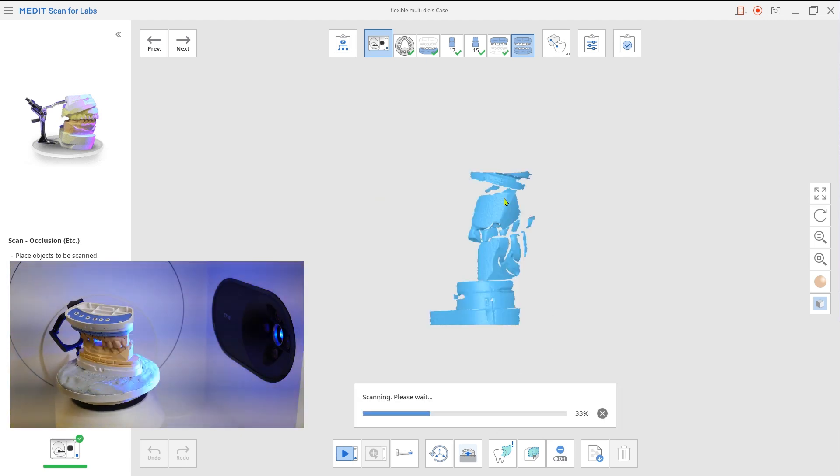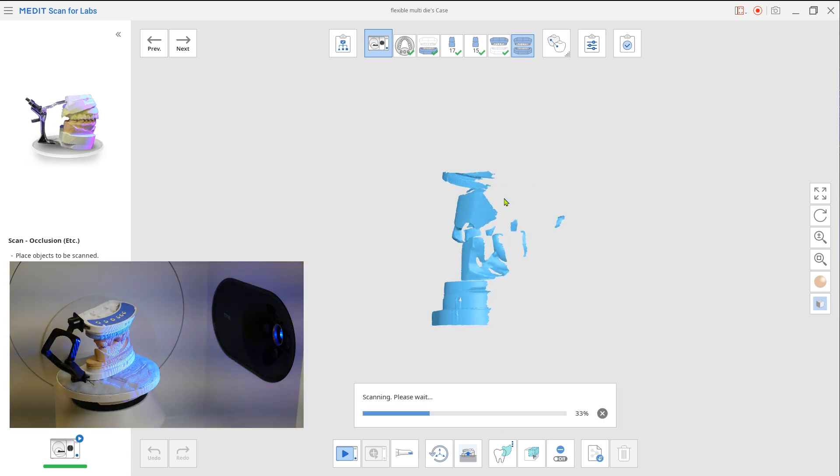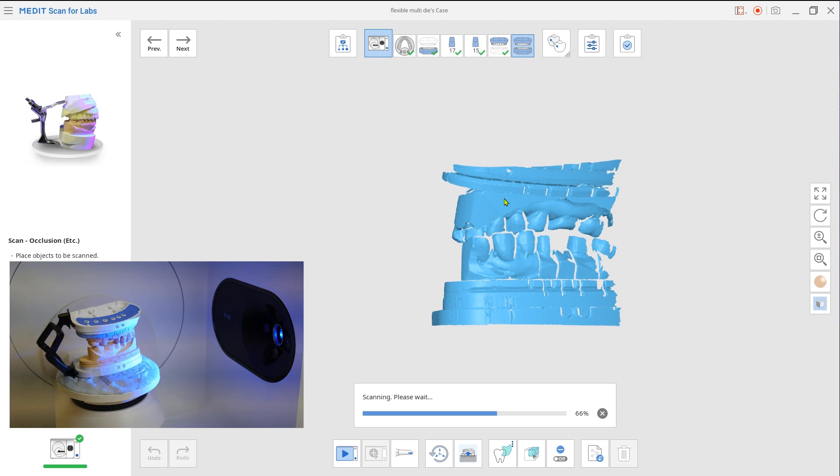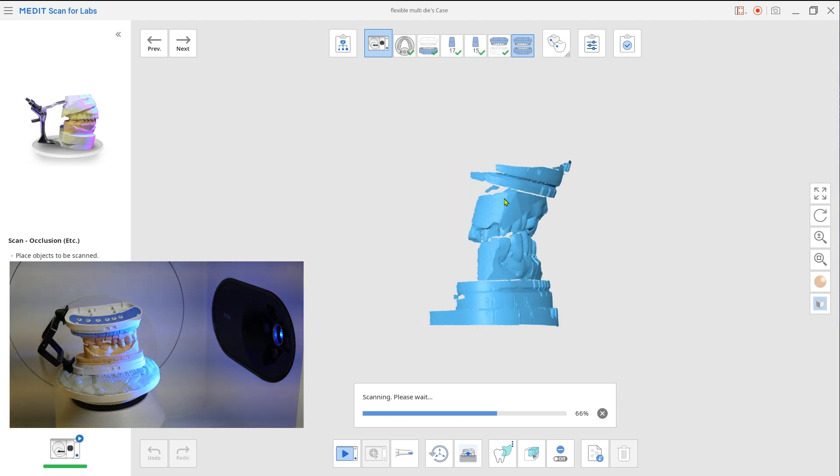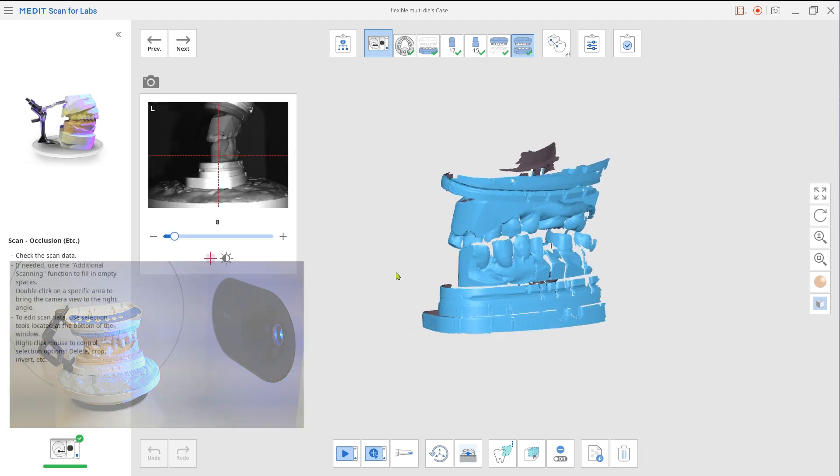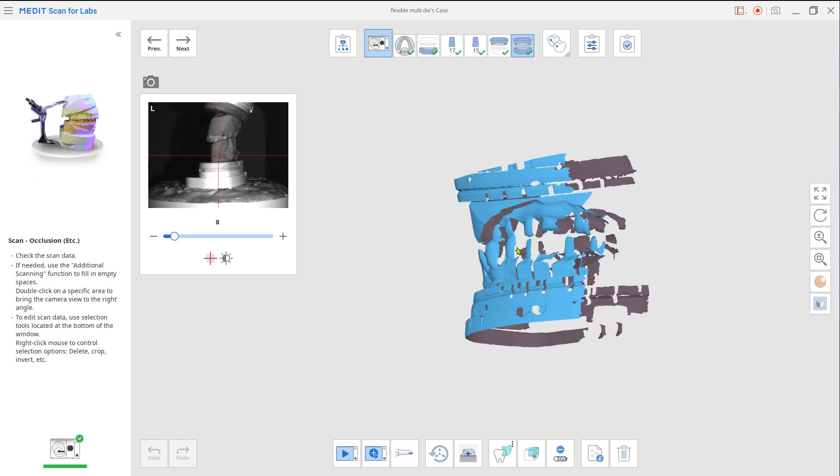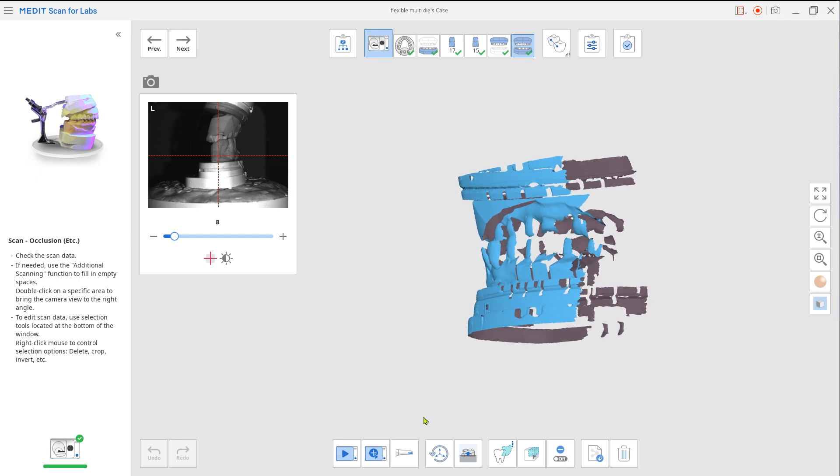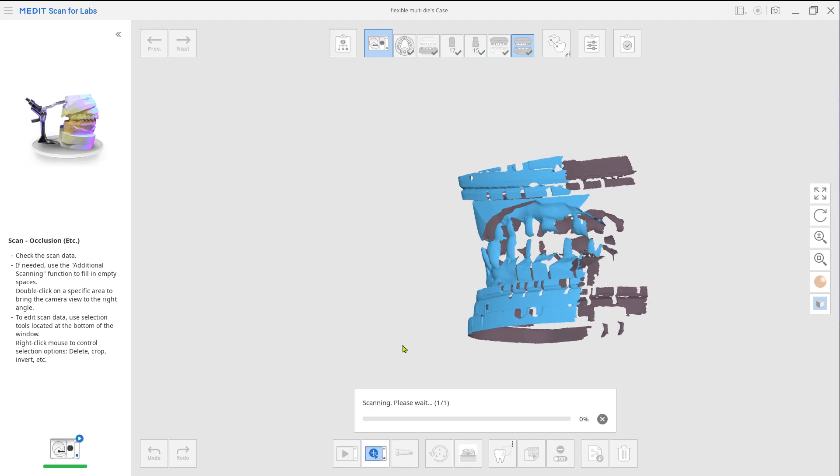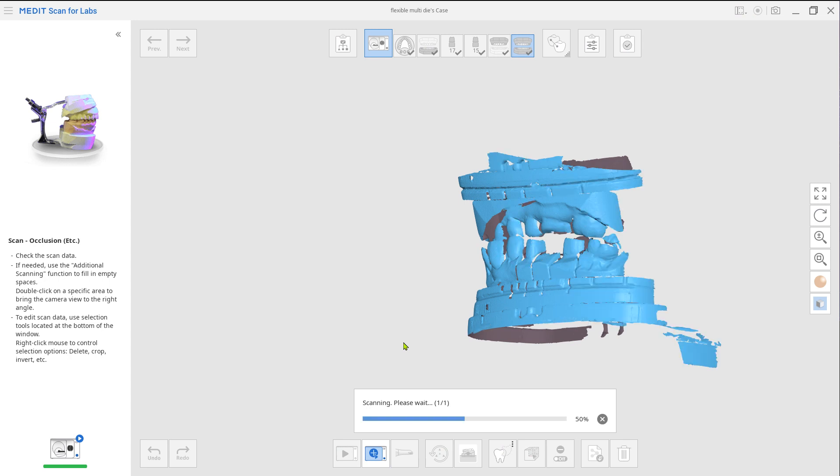Have your upper and lower model be in occlusion and place it on the jig. After the initial scan, perform an additional scan from the disto-buccal side for better alignment later.